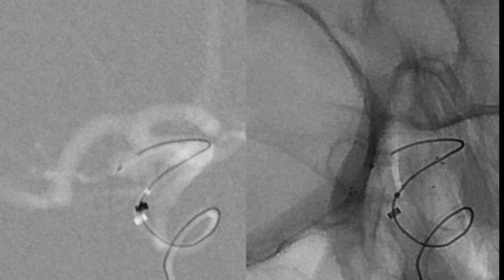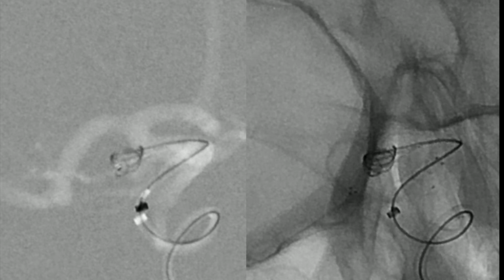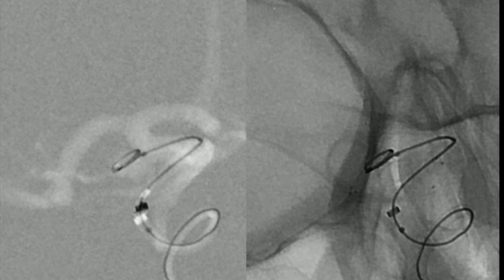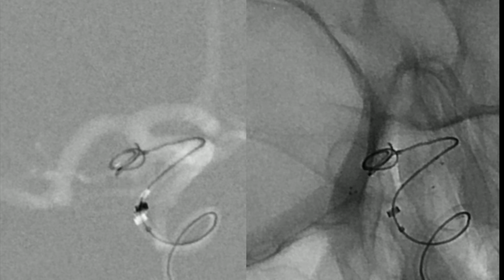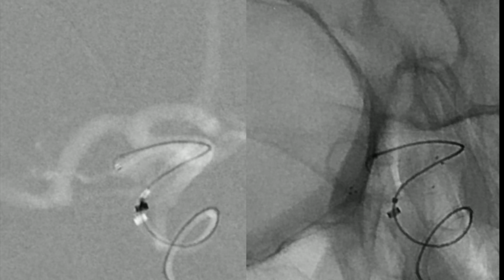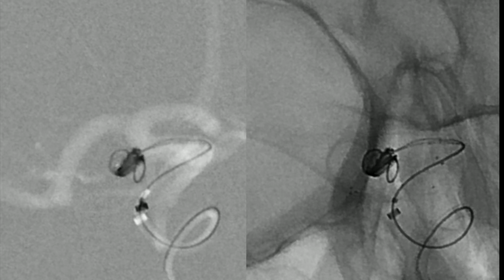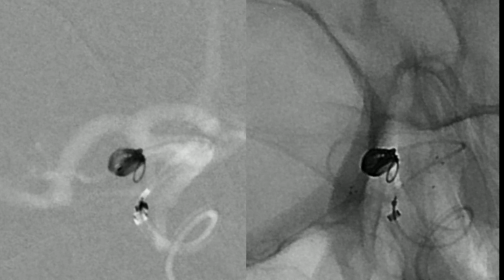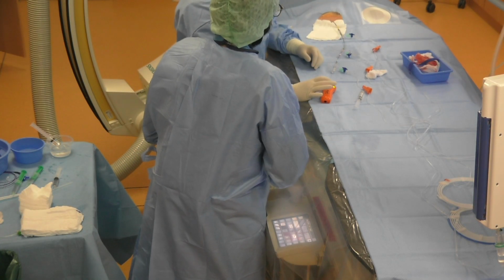And we're approaching the aneurysm, and now we need to pull the microcatheter a little bit back to remove the tension from our system. We don't need the end of the coil to go in the lumen of the artery. That's why we will push and pull and try to get a good position and form of the coil. And as you can see, now we are in the aneurysm sac, and there is nothing in the lumen of the vessel. And so we can detach the coil with the in-zone device.